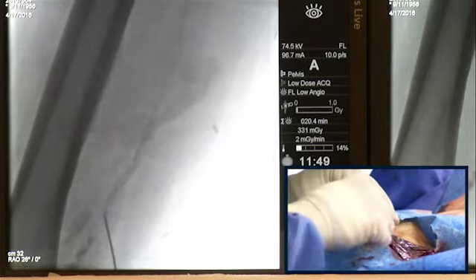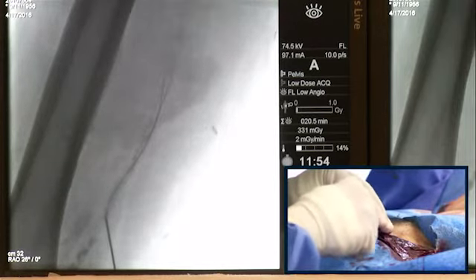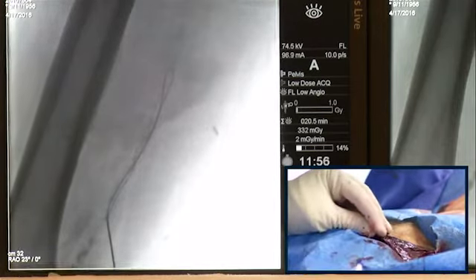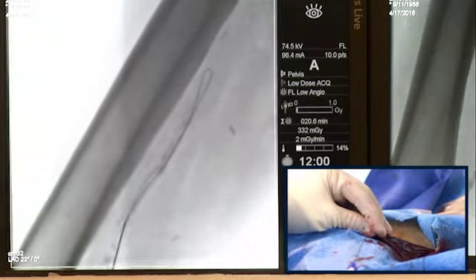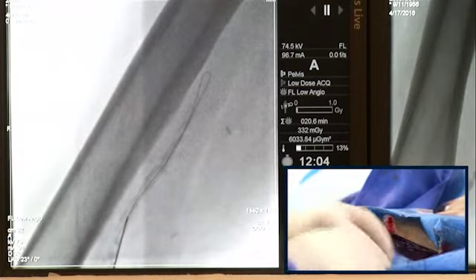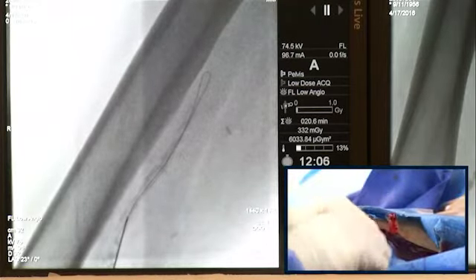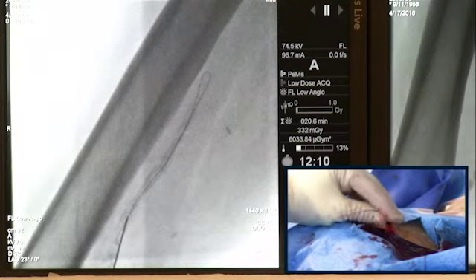Okay. Of course, Andre is always right, so that's why we listen to him, and that's why we have him here to help us. But you saw how we did that. I think that was hopefully a good teaching point. So now we are in the artery. So the key is, again, the points that Andre mentioned earlier this morning. Watch that wire doesn't come out, Andy, please.